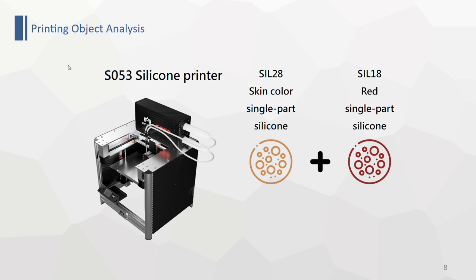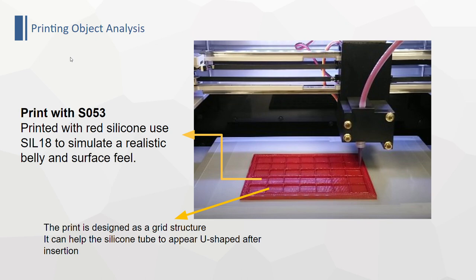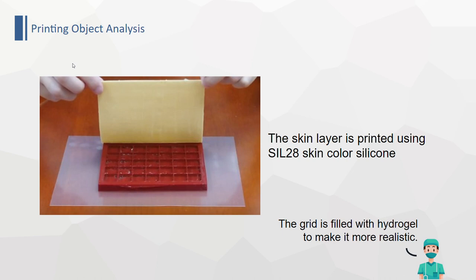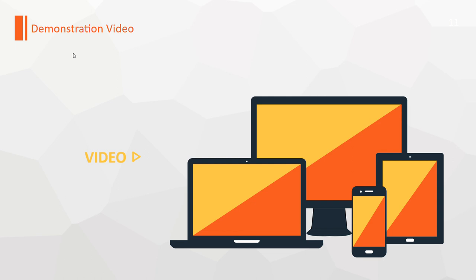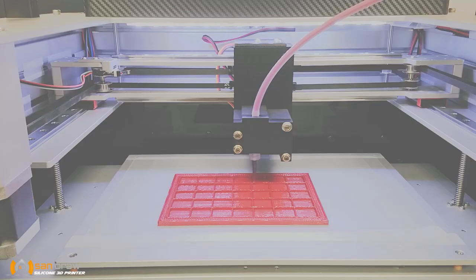We chose the S053 silicone 3D printer to print this teaching aid using SIL28 skin-colored one-part silicone and SIL18 red one-part silicone. The picture shows the process of printing. We chose red silicone to simulate the actual abdomen, and skin color to represent the skin. Finally, we glue them together. For the next part, we are going to show you the video of the printing process.